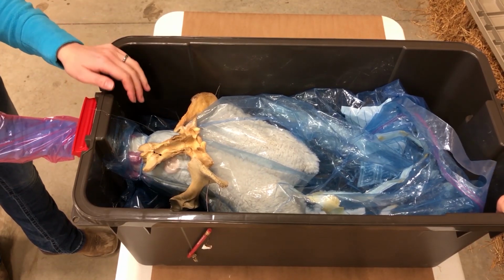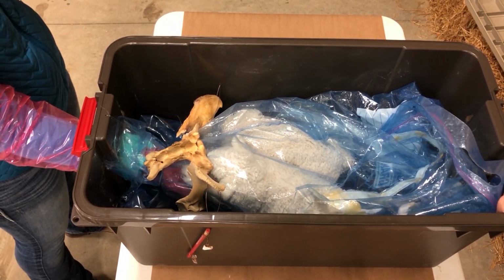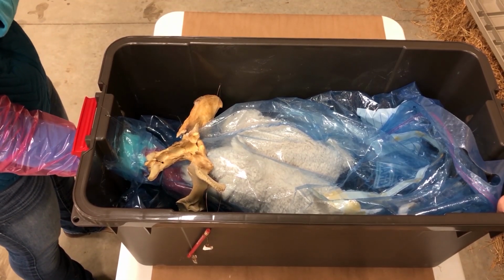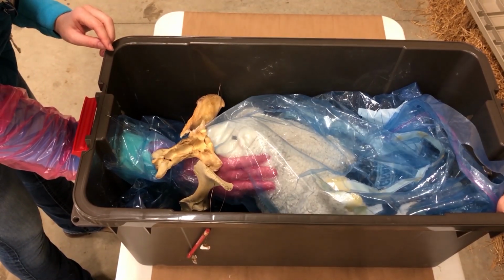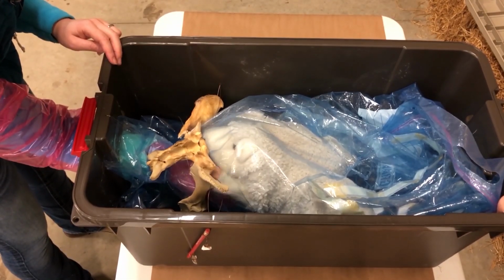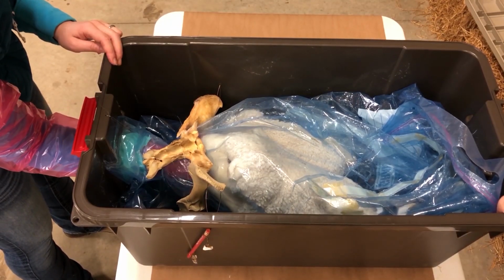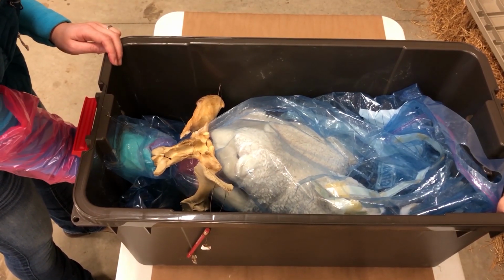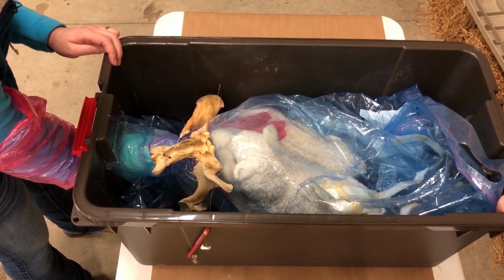Something is not right. So before I ever pull, I want to be sure that the legs that I feel connect to the head that I feel. So as you have your legs, be sure you run up the side. Yep, this front leg right here that I've got in my hand definitely matches this lamb. So I go to the other leg that I have, and it definitely does not match the one that I have.